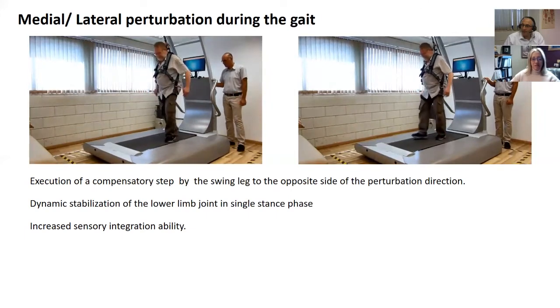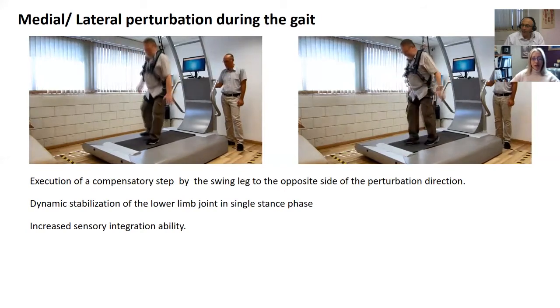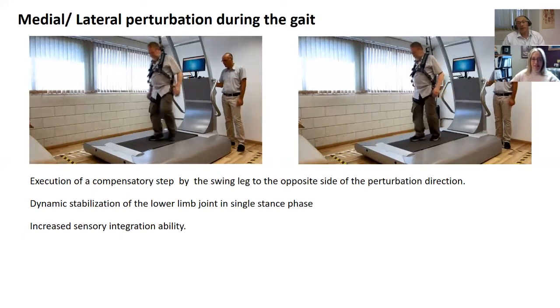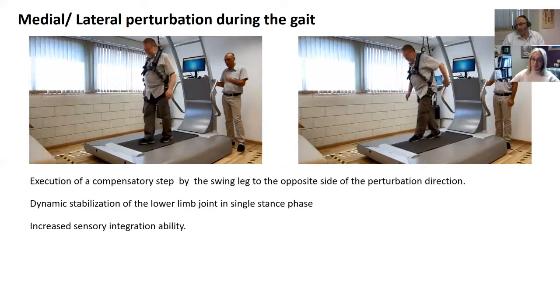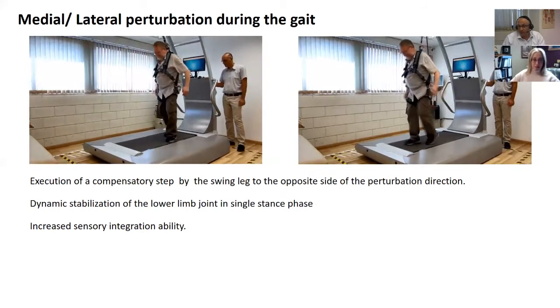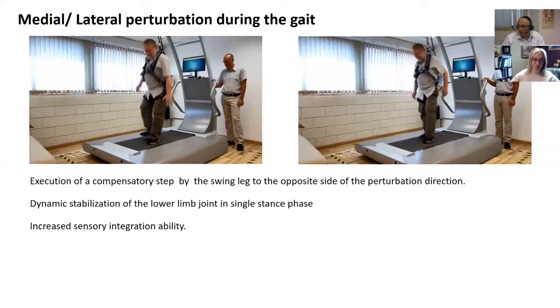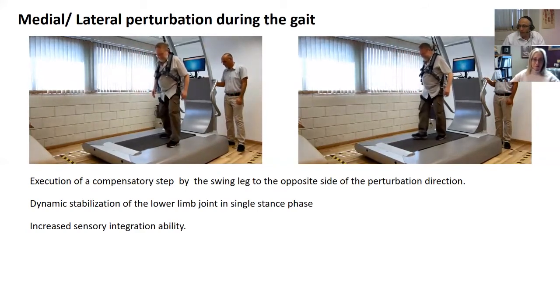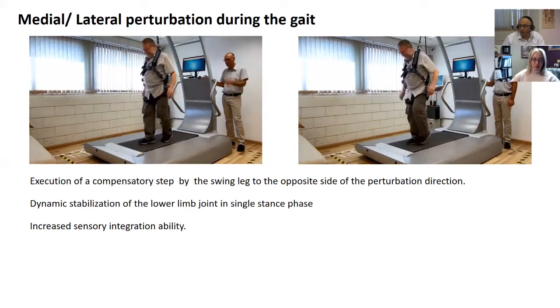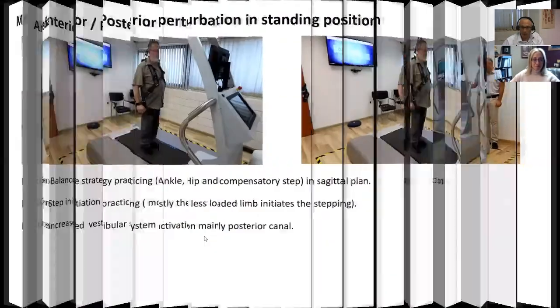I believe, obviously, I'm not sure, you would have to help me with that, if he's in the middle of his rehab. No, he's definitely chronic here. He's a patient now, about 4 years post event. Okay, so he comes, if you like, for little top-up sessions, of 10 sort of top-up sessions, that sort of thing. So yeah, it's really chronic here. Okay, right.